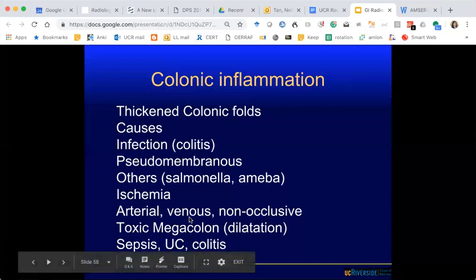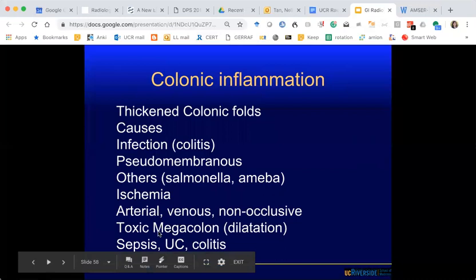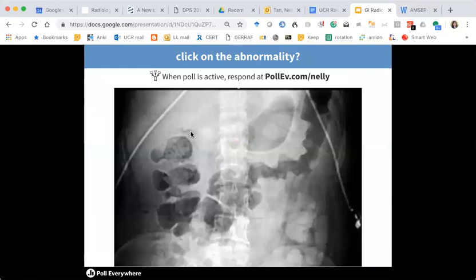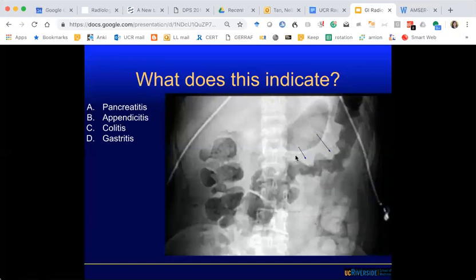Another thing is bowel thickening — a secondary sign of an underlying disease process, which could be from infection, ischemia, or IBD such as Crohn's or UC. As everyone correctly stated, we have this thickened appearance of the transverse colon. The sign for this appearance is the thumbprint sign — as if someone put their thumb on it and printed. It just means there's thickening of the colon — we don't know the underlying cause without clinical context and further imaging.